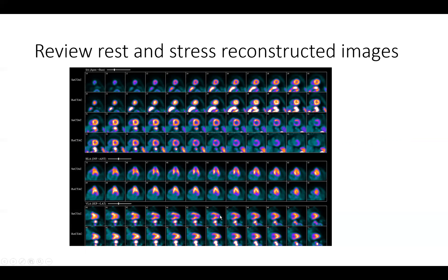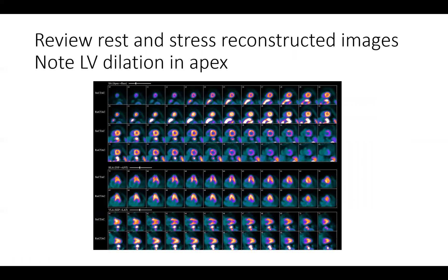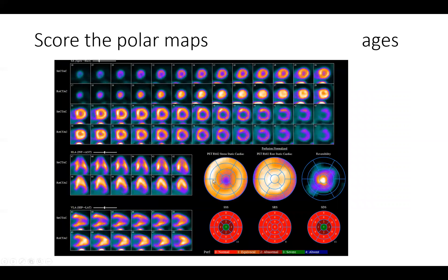When you go to the stress images you can see a similar pattern, except now we have a new perfusion defect in the apex with focal dilatation of the left ventricular apex right here. So we have a LAD perfusion defect involving the apex of the left ventricle, indicating ischemia. This is just to show you that defect again and bring your attention to the change of left ventricular size — systolic and diastolic — from the rest images to the stress images with LV dilatation.